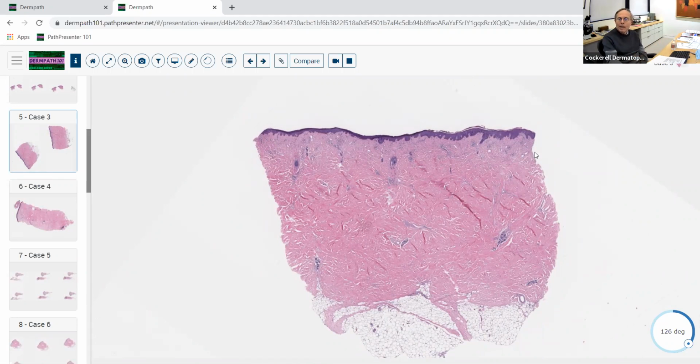The other thing we talk about is the squared-off biopsy appearance when you see it at low magnification. That's a clue that you're really dealing with sclerotic collagen versus just a thick dermis like a lot of people have. If you get a biopsy from the back of a lot of these men we see from the VA hospital, all of their skin looks pretty thick there. But it's not sclerotic. They have plenty of fibroblasts in their dermis.